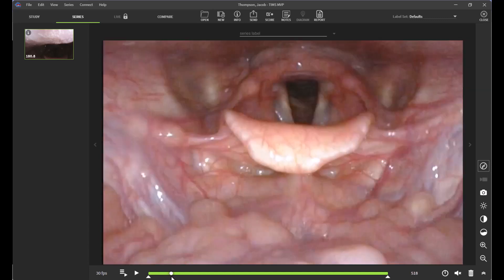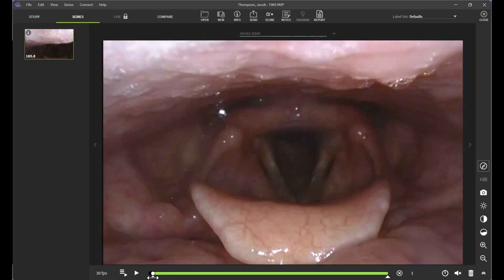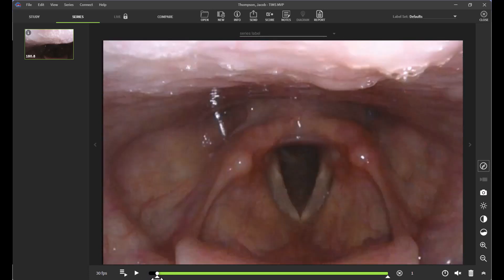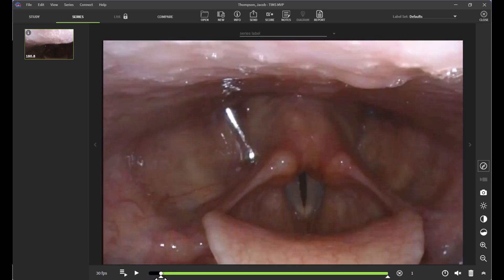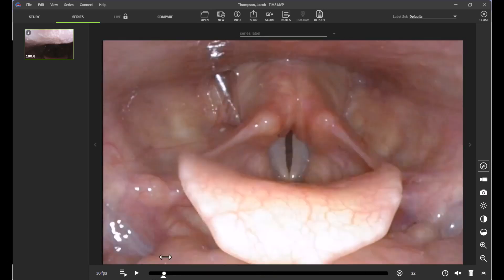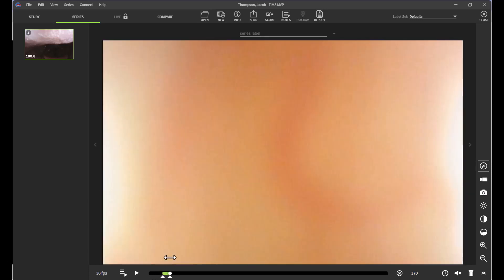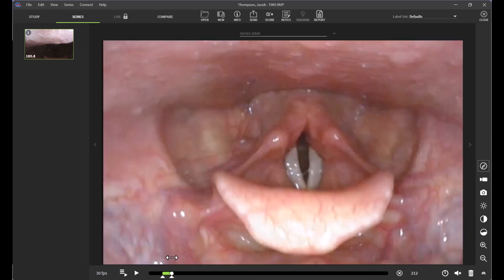We've got an initial trial of thin liquids, so I'm going to isolate that out as my first subclip. I'm going to drag a little bit down the line just because we don't necessarily need some of this information. Then I'm going to take my triangle on the other side and drag to determine what all I need, and I'll stop right there after that first swallow.